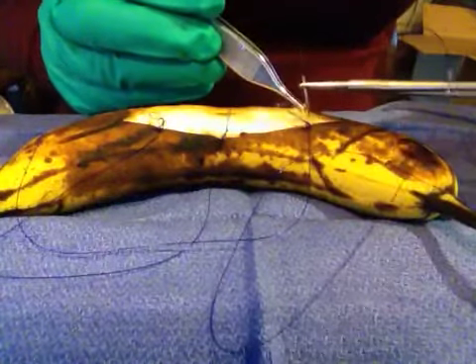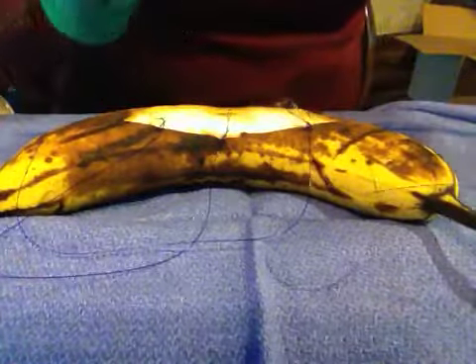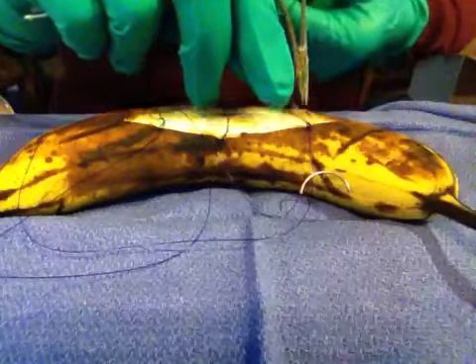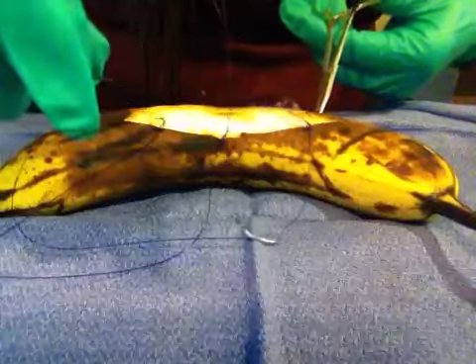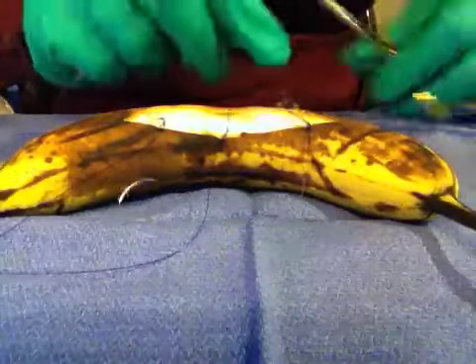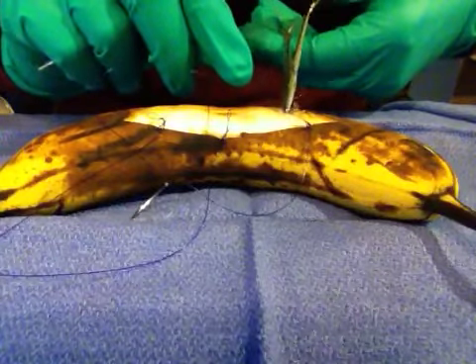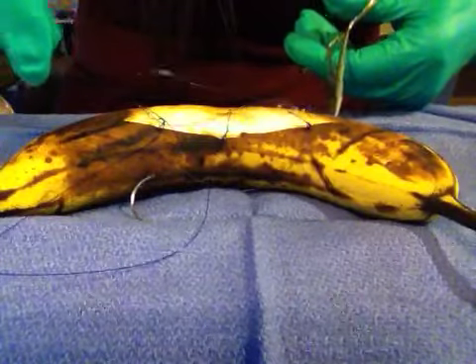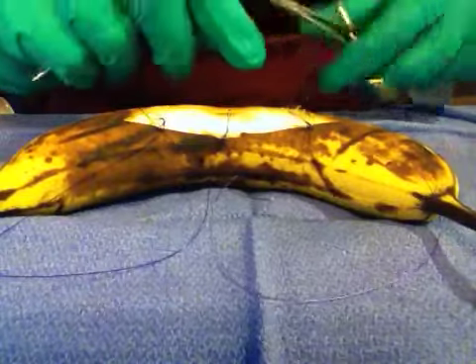One across and the other. And this is called a stent dressing. One, two. One, two.